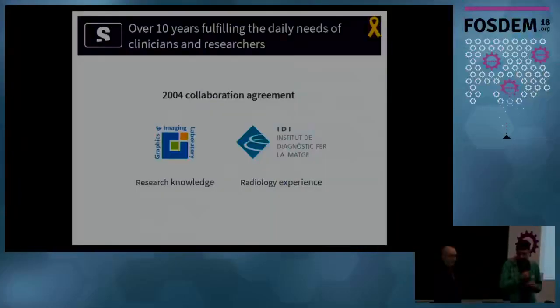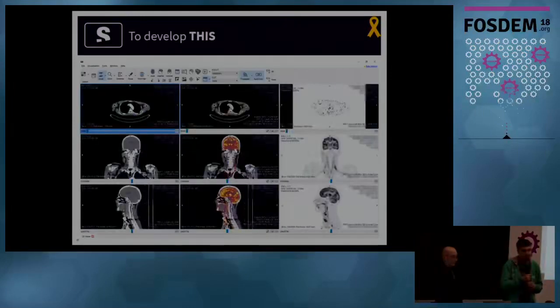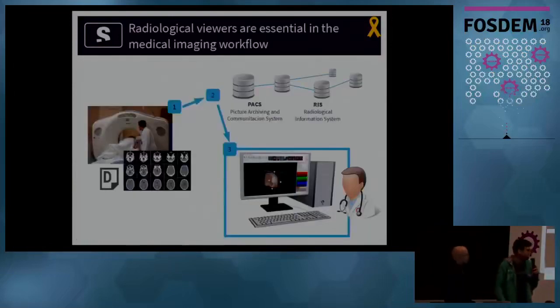In 2004, a collaboration agreement was signed between the Graphics and Imaging Laboratory and IDI, Institut de Diagnòstic per la Imatge. In this agreement, GLab provides research knowledge and IDI radiology experience. The objective of the agreement was to develop this. This is Starviewer, which is a radiological viewer.